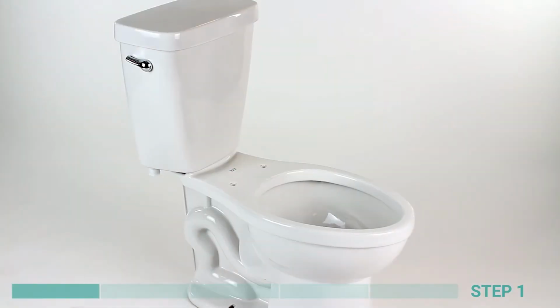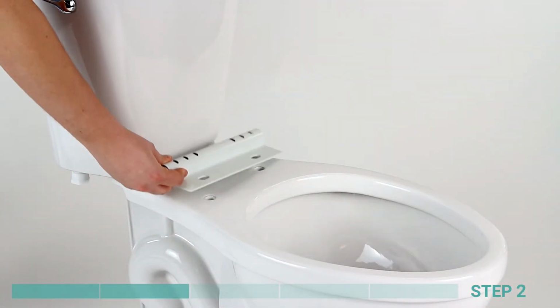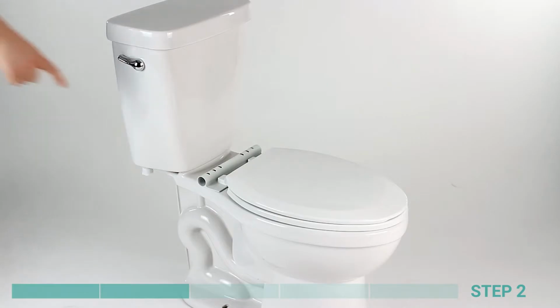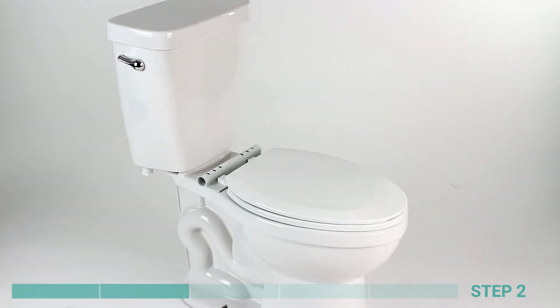Step 1. Remove the seat and lid from your toilet. Step 2. Align toilet bracket with existing holes in your toilet and reinstall your toilet seat and lid, securing the bolts through the bracket holes.